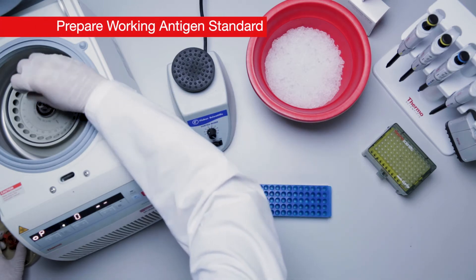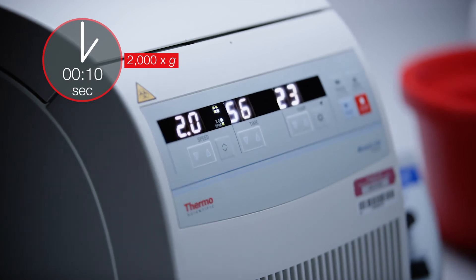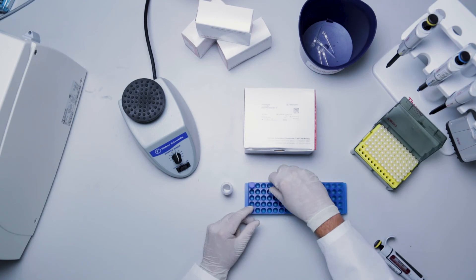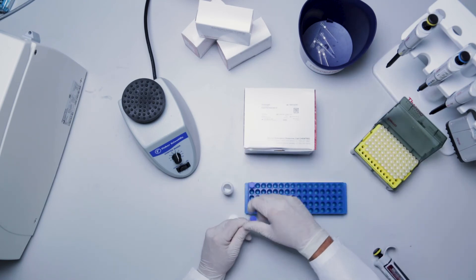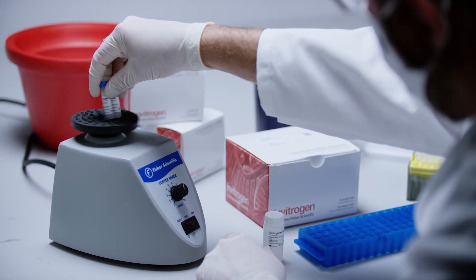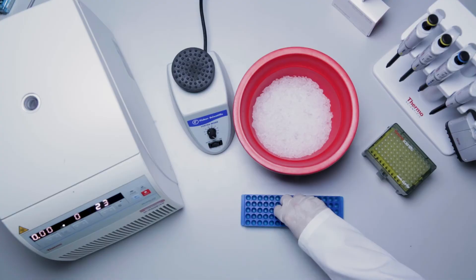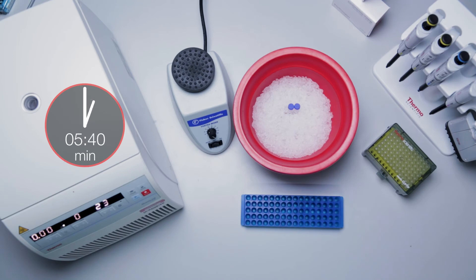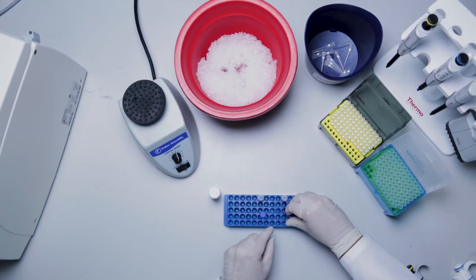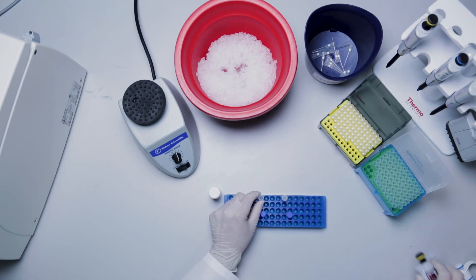Centrifuge each different standard vial at 2000 g for 10 seconds. Add 50 microliters of universal assay buffer or cell culture medium to each vial. Vortex each antigen standard vial at high speed for 30 seconds. Centrifuge at 2000 g for 10 seconds to collect the contents at the bottom of the vials. Incubate on ice for 10 minutes to ensure complete reconstitution. Transfer the entire contents of each vial into one of the vials and fill with sample type-specific buffer to a total volume of 250 microliters. Pooling of antigen standard vials to prepare the working antigen standard must never exceed 250 microliters.